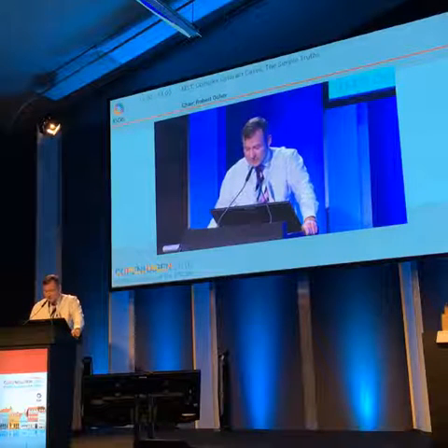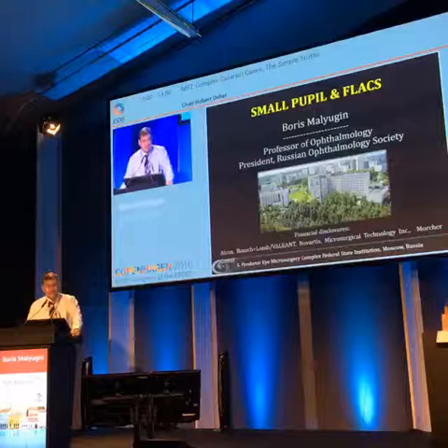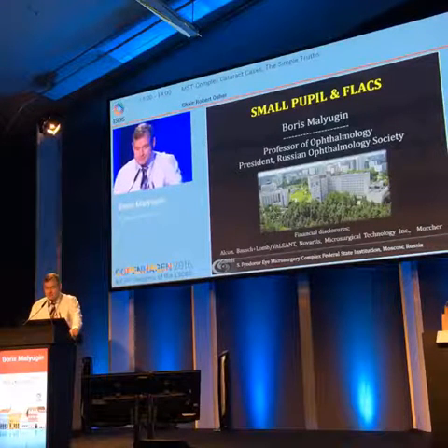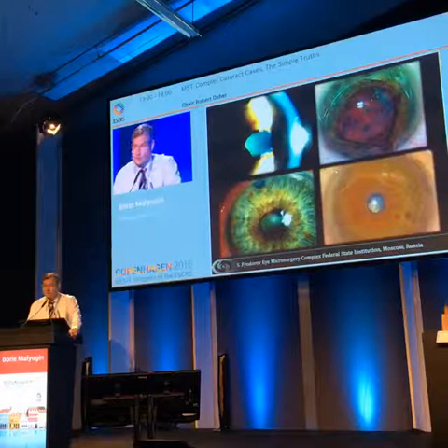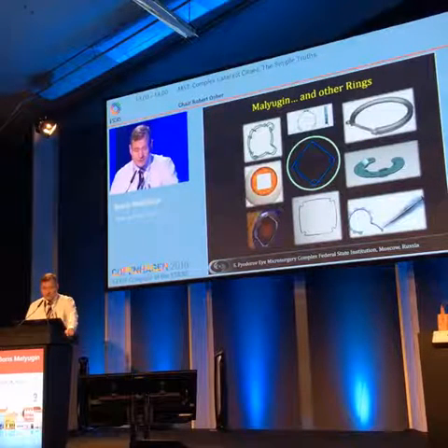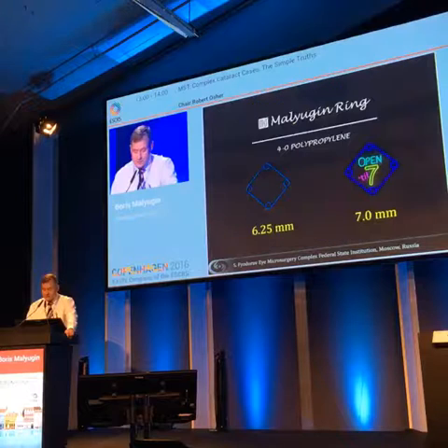So what I will be talking about today is maybe a little bit of a hot topic. We know that femtosecond cataract surgery arrived about 8 years ago into clinical practice. And of course, by introducing new technologies, sometimes we are introducing some issues. We know that eyes with small pupils are challenging, and this is definitely related to these particular cases. And of course, we know that there are many other options to expand the pupil, and we will be focusing on one of these options, the Malyugin ring.